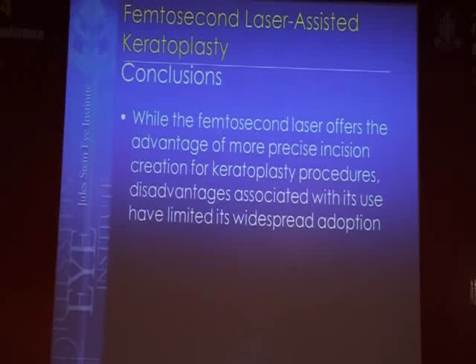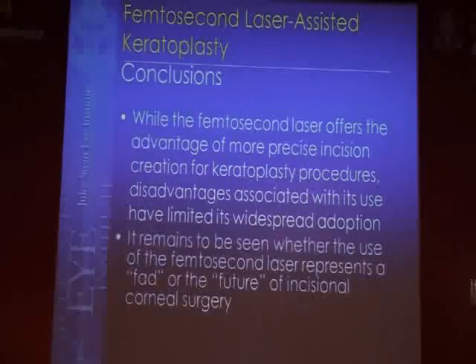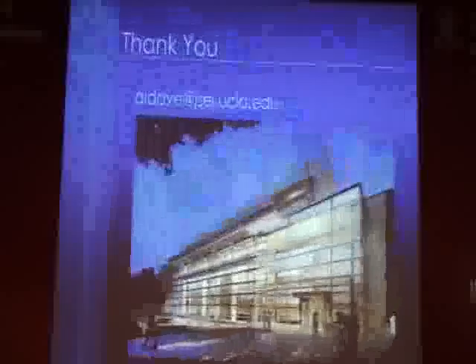So in conclusion, while the femtosecond laser offers several advantages, such as more precise incision creation, the disadvantages have really limited its use both in the United States and, I think, internationally as well. So I think right now it really remains to be seen whether this represents the future of incisional corneal surgery or just a passing fad. Thank you very much for your attention.